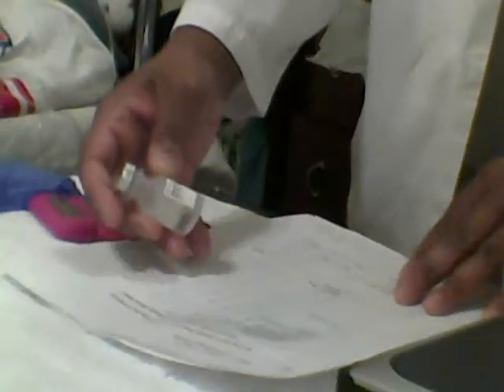The first thing we will do is check our medication against our order. We have here digoxin 0.25 milligrams over 1 milliliter. Digoxin 0.25 milligrams — we are administering 1 milliliter over 1 minute. So our calculations will be 0.25 milligrams per 1 milliliter for 1 minute.